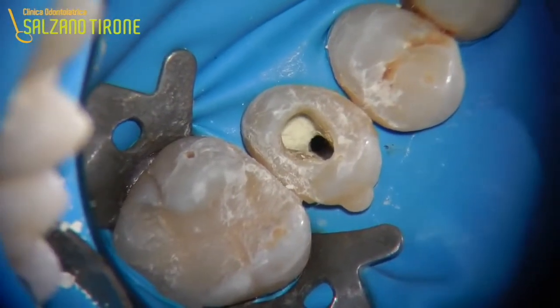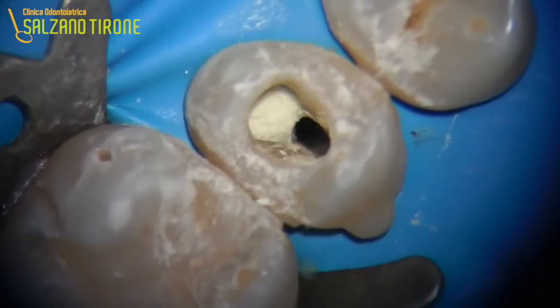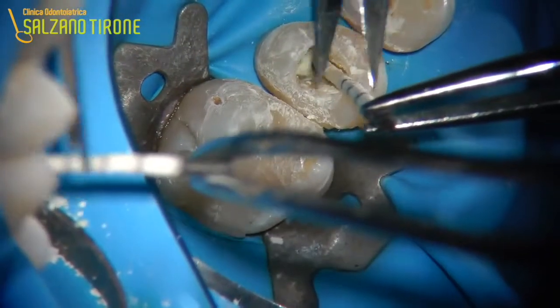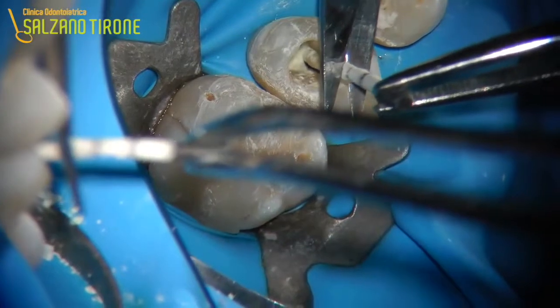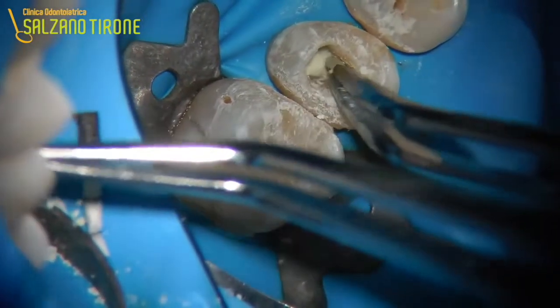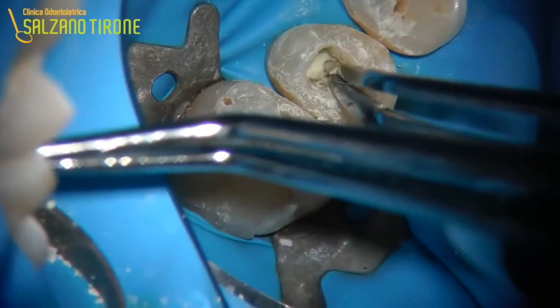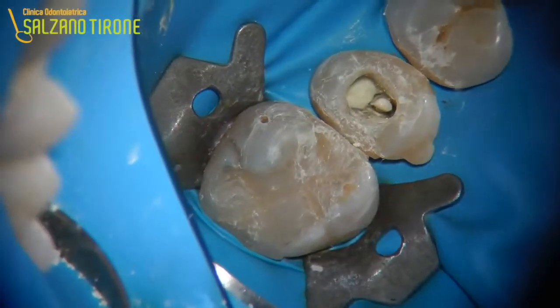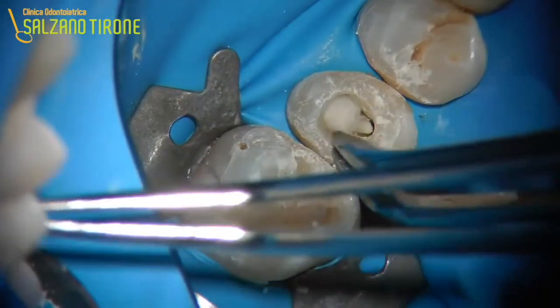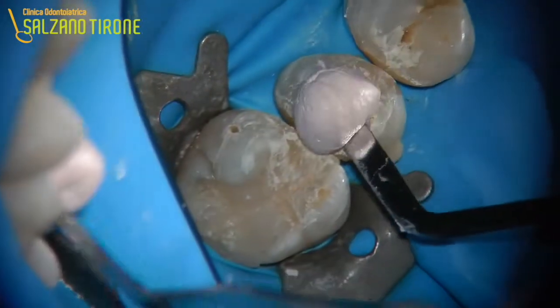By treating a tooth like this, you can see that the approach is very conservative, and I don't think that such a treatment can only last a short time, as Heithersay stated in his papers. That's a tooth I choose to rehabilitate with a first-class filling, because the patient was intercepted during an invisible orthodontic treatment and I didn't want to change the tooth shape. Since the result of the filling was good, as you can see in my blog, and it looked fine, I left it, given the tooth was perfectly solid in its coronal part.